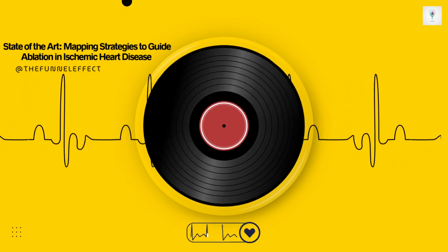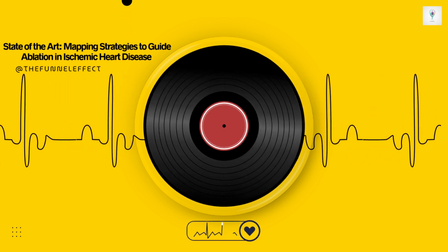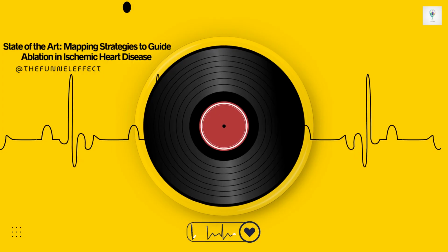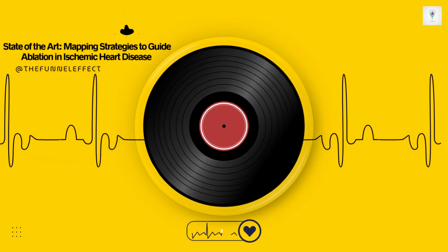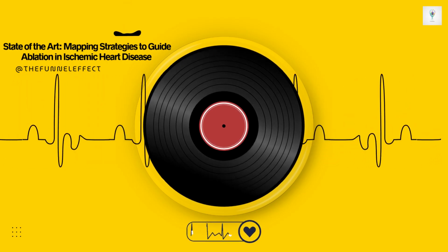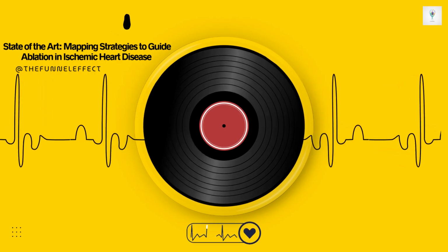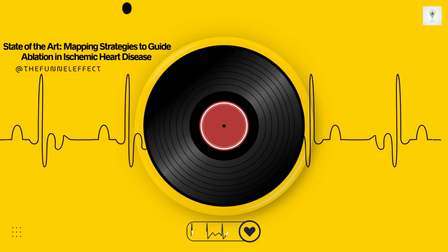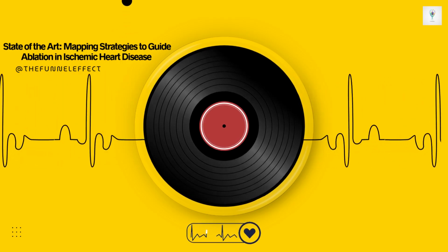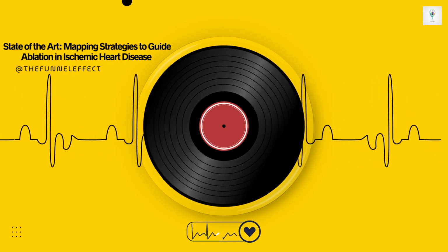If the electrical wave is moving quickly across the tissue, the isochrones representing sequential time points will be spaced far apart. But if the wave hits a zone of very slow conduction, it crawls. And those isochrones get packed tightly together, they become crowded. Like a traffic jam for the electrical signal. It's exactly like a traffic jam. The clinical definition of significant crowding often involves seeing, say, more than 4 distinct isochrones within a 1 centimeter area. This density corresponds to a calculated conduction velocity of less than 25 centimeters per second, which is extremely slow for heart tissue.